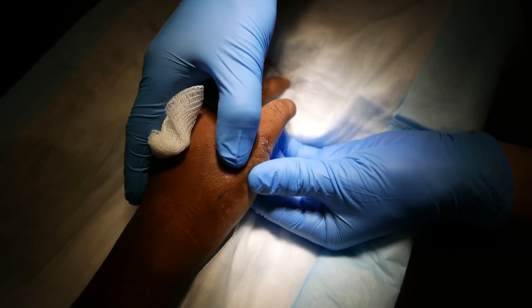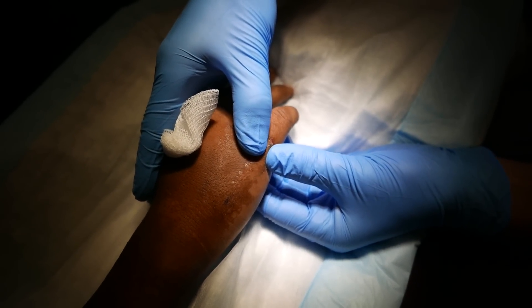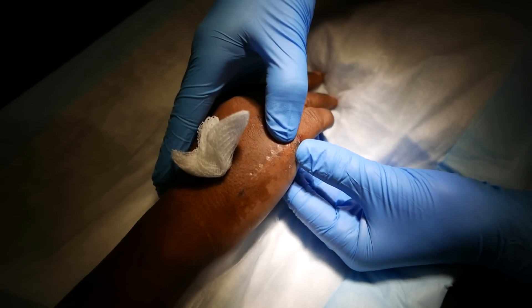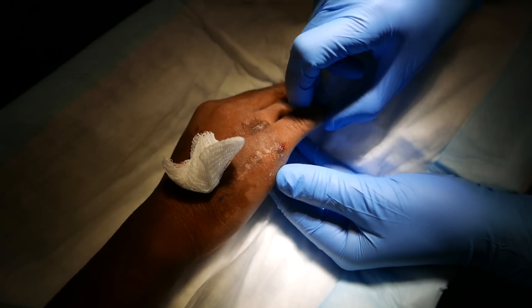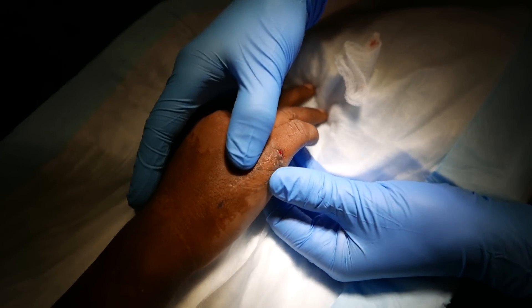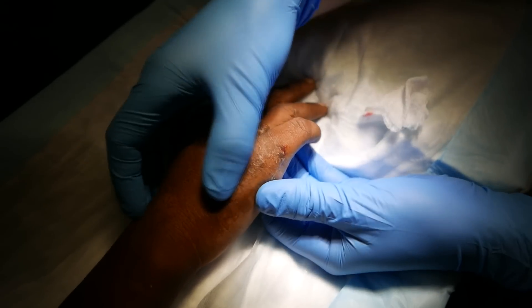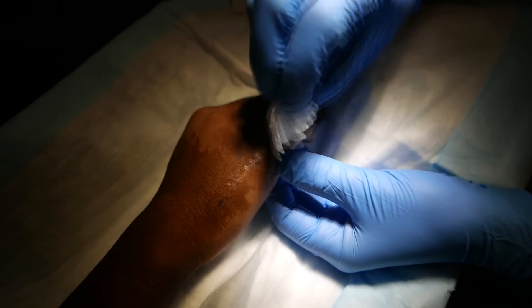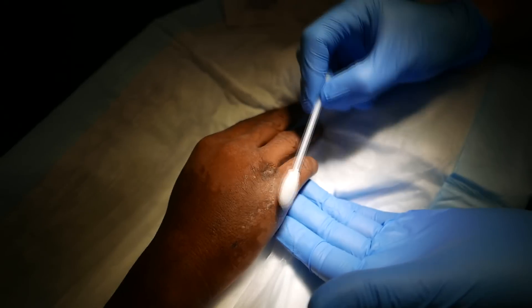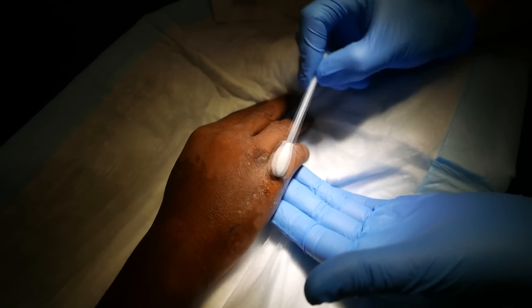We're going to send him out on some antibiotics and go ahead and splint this boxer's fracture. These videos end up on YouTube — you guys are okay with that? We're going to splint the hand and then you're going to see the plastic surgery specialist in one day. Let's clean that off a little bit and put some antibiotic ointment on top — triple antibiotic. Then we'll come back and do a splint for this boxer's fracture.